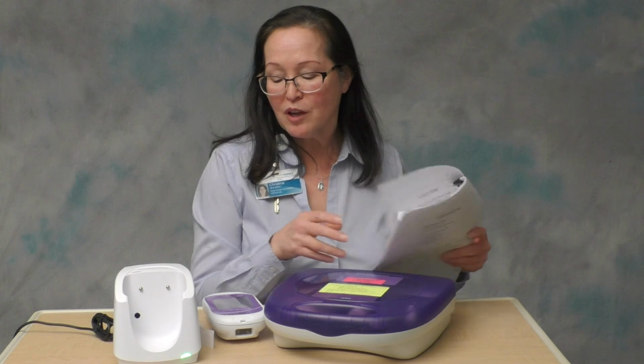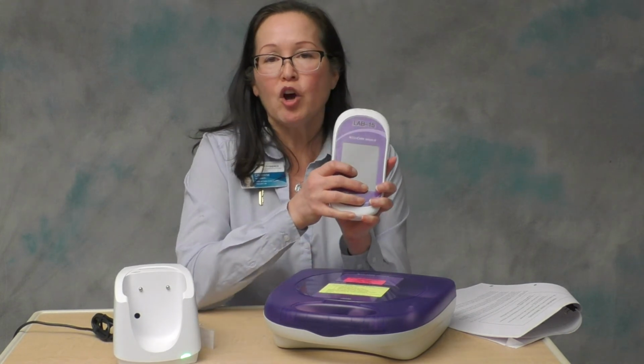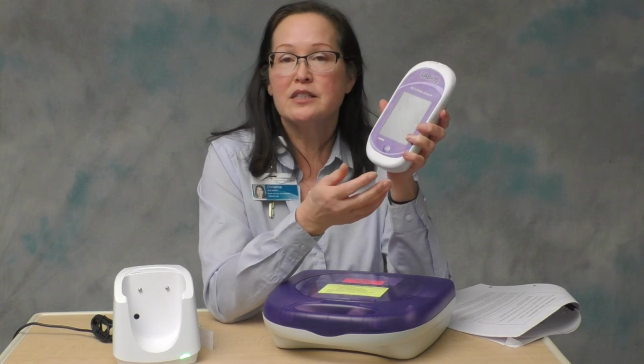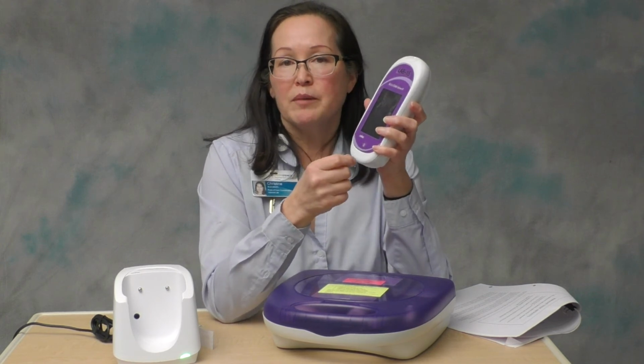Okay, so patient test results will all cross into Epic and show up in the patient's chart. There is one comment that you can attach to a patient result that will keep the test result out of Epic. So if, for example, you realize that you ran the test on the wrong patient, or there was some kind of error code, or maybe the test result was not consistent with the patient's clinical picture and you want to recheck it, if you want to keep that result out of the patient's chart, you can attach the procedure error comment to it. So you need to attach comments before you accept your result.